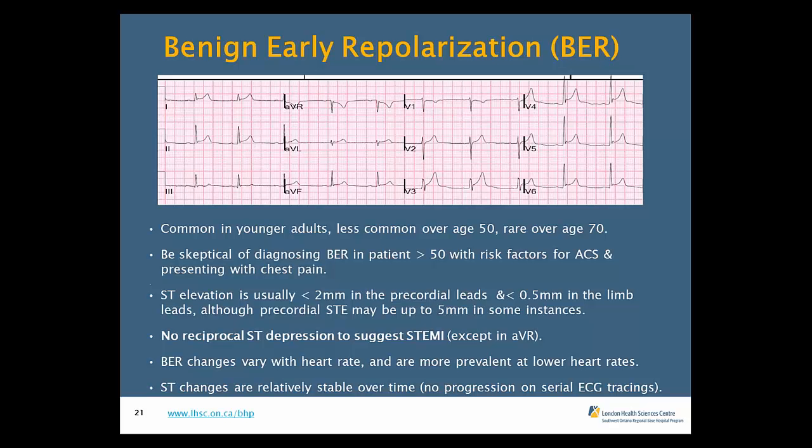And again, looking at this ECG here, at first glance you may say, yep, look at that ST elevation. I see ST elevation in 1, 2, something going on there in aVF, and then starting in V2 all the way to V6. But again, looking for those reciprocal depressions. Are there reciprocal depressions going on? And we don't see any true reciprocal depression. So there are very few ischemic causes of widespread ST elevation across all leads in the ECG.